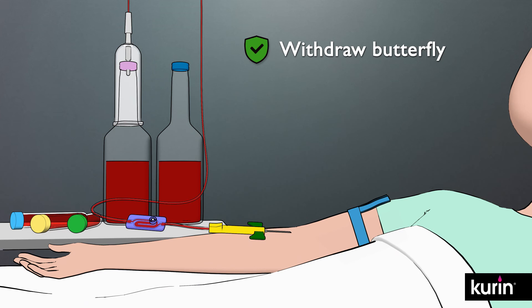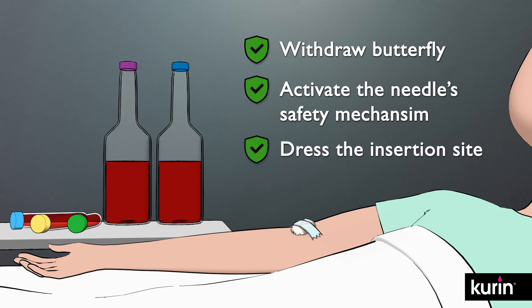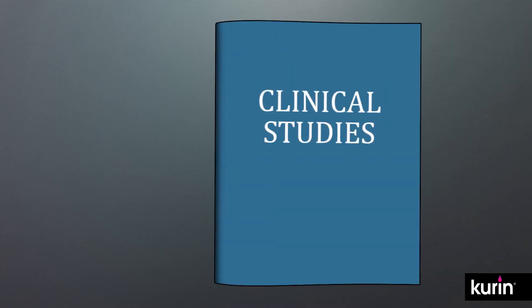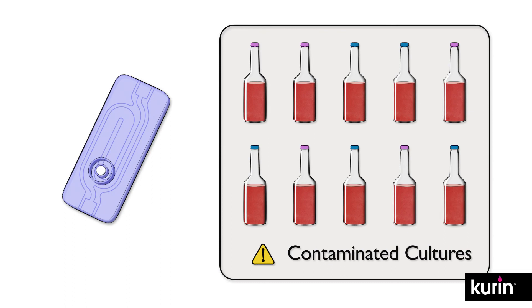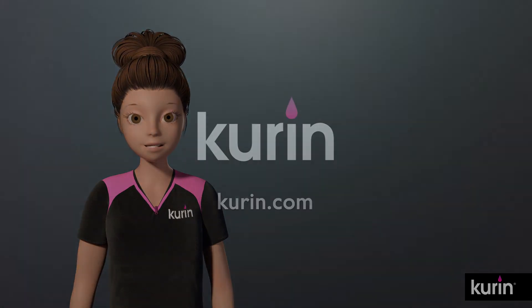Now withdraw the butterfly, activating the needle safety mechanism, and dress the insertion site. Dispose of the Curin device according to hospital policy. Studies show that best practice compliance, combined with flash technology to sideline the initial flash of blood, can reduce contaminated cultures by more than 80%, improving the clinical value of blood culture testing for safer, more effective, and lower cost treatment of patients.